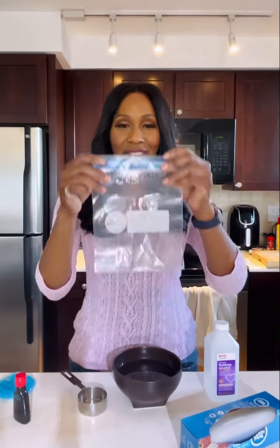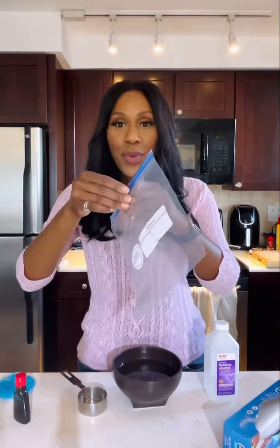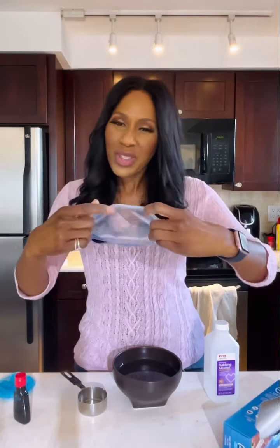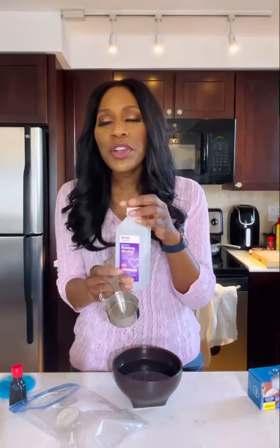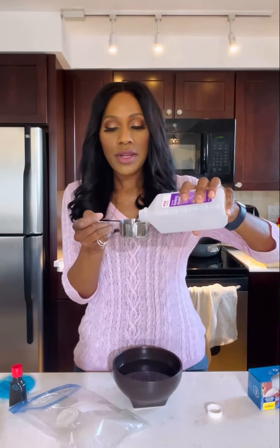Okay, so are you ready? Here we go. All right, first thing, you got your freezer bag. Simple, you get this over the counter. You wanna open up that freezer bag. Also, you wanna make sure it's got a good closure, okay? Because you will eventually put this in the freezer. You wanna make sure that the liquid doesn't leak, okay? First thing we do is we're going to take 1/3 of a cup, which is my unit of measurement, okay? So whatever your unit of measurement is, 1 cup or whatever, you're gonna put 1 of these in the bag, okay? So I'm gonna do 1 unit here of the alcohol.